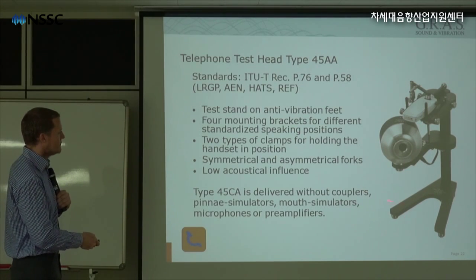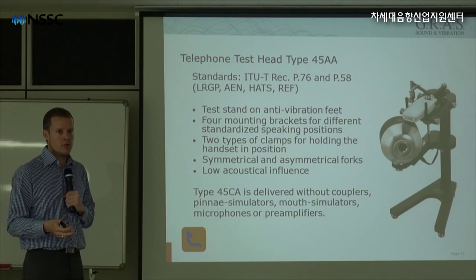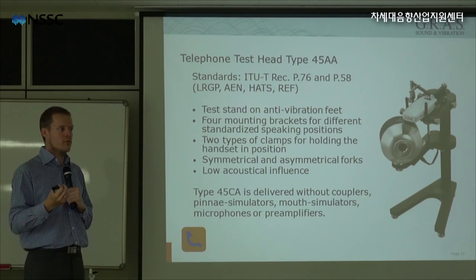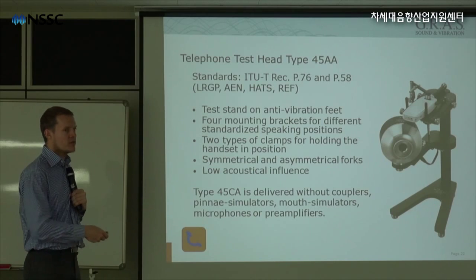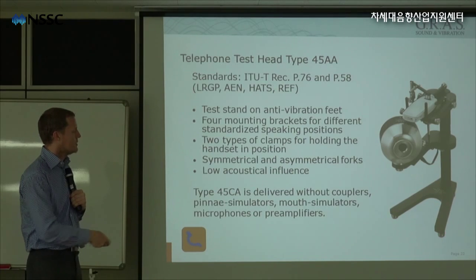And also on the feet, you can see it has some special feet here which isolate from vibration. So if you have some severe background vibration where you are doing the test, we can isolate a lot of this vibration through the setup, in the isolators in the feet.